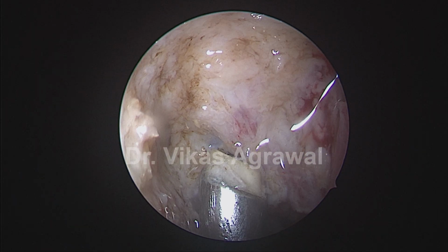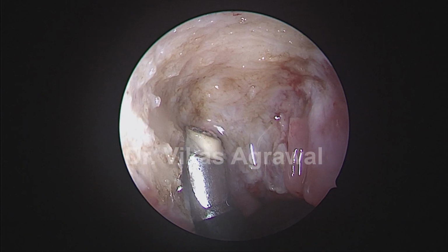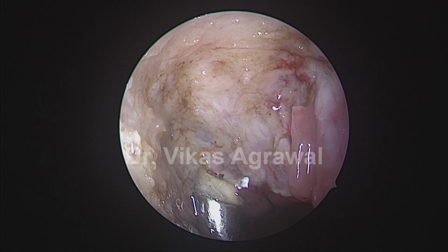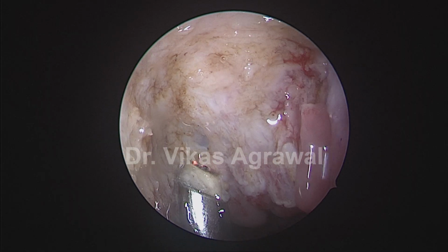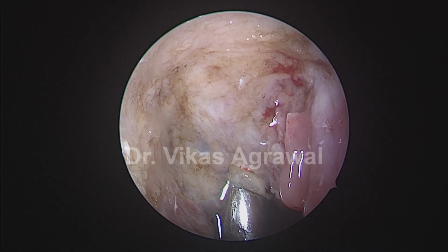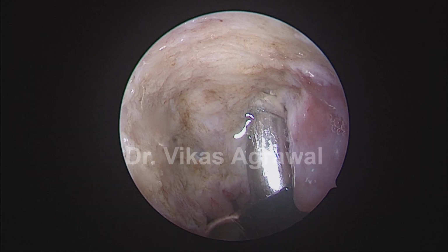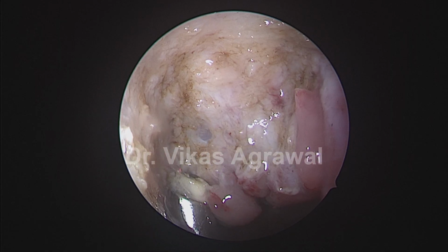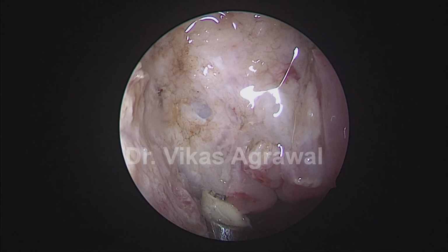Can you see the buccopharyngeal fascia? That is my posterior boundary. I'm not supposed to open it up, I'm only supposed to define it. If I open it up, muscles will be exposed and the child will have pain on lifting the head. So that is the buccopharyngeal fascia, which is the posterior boundary. This is the fossa of Rosenmuller.